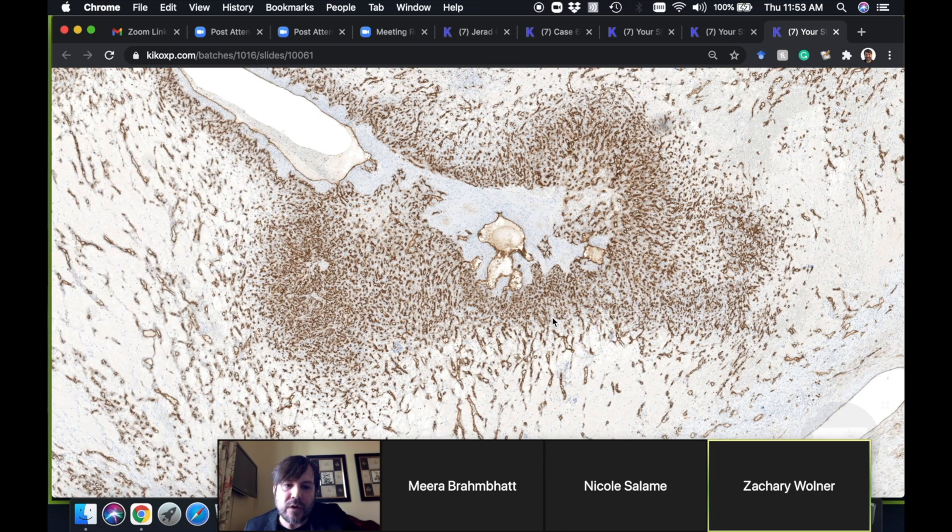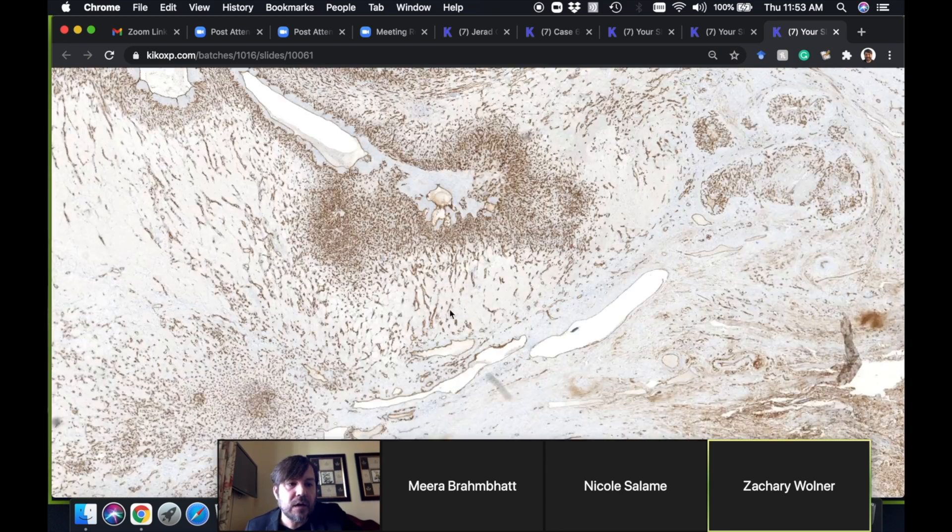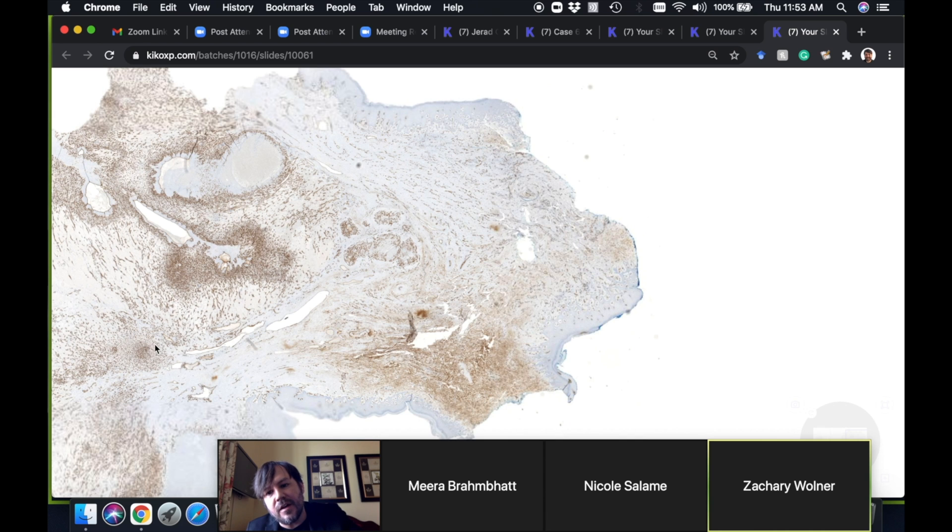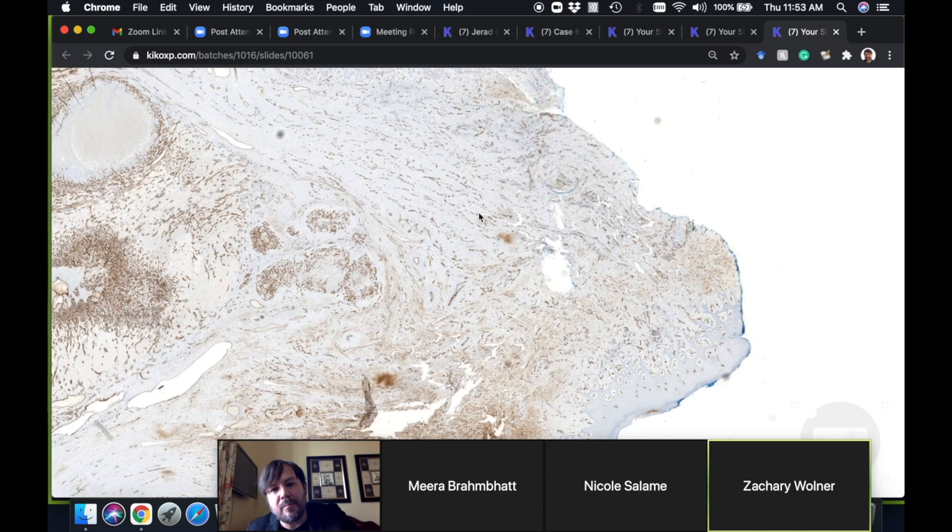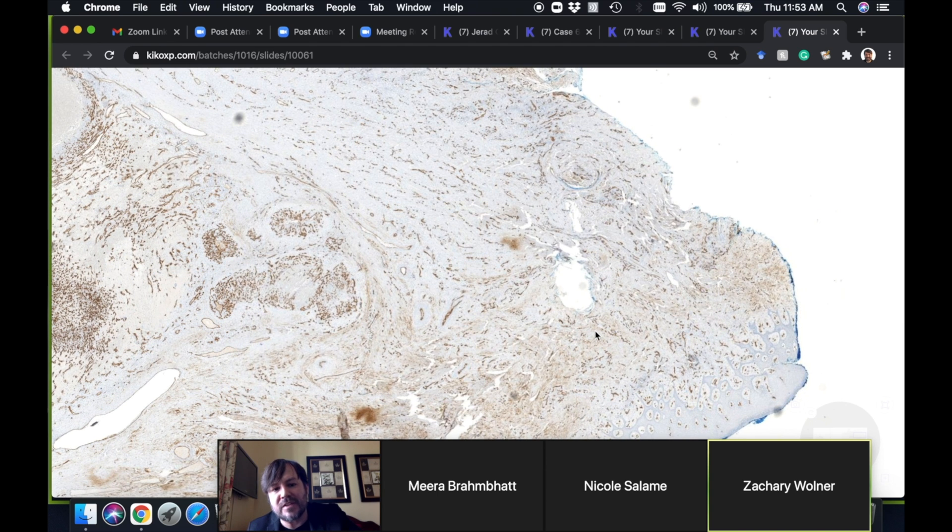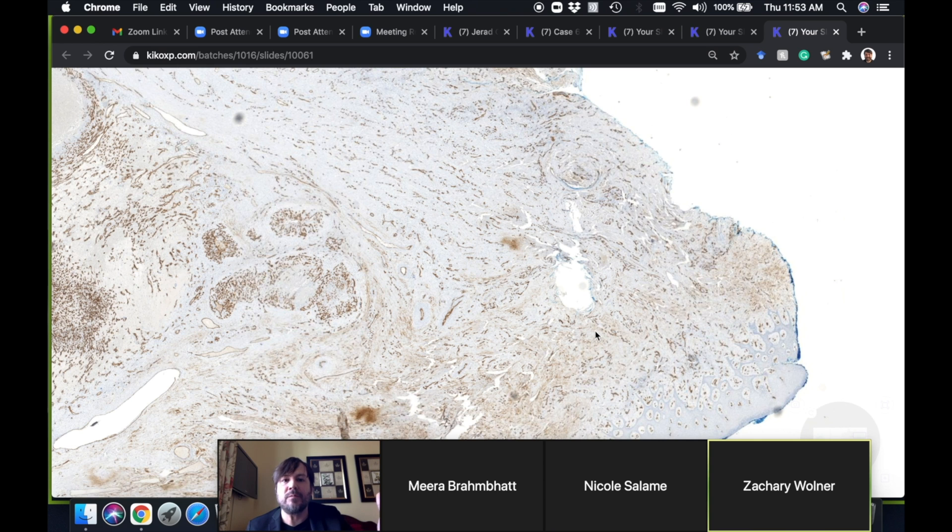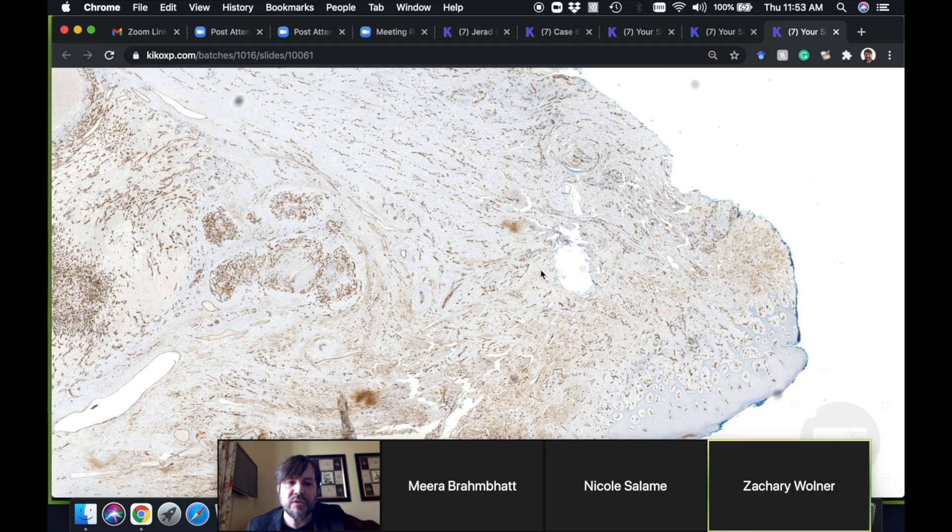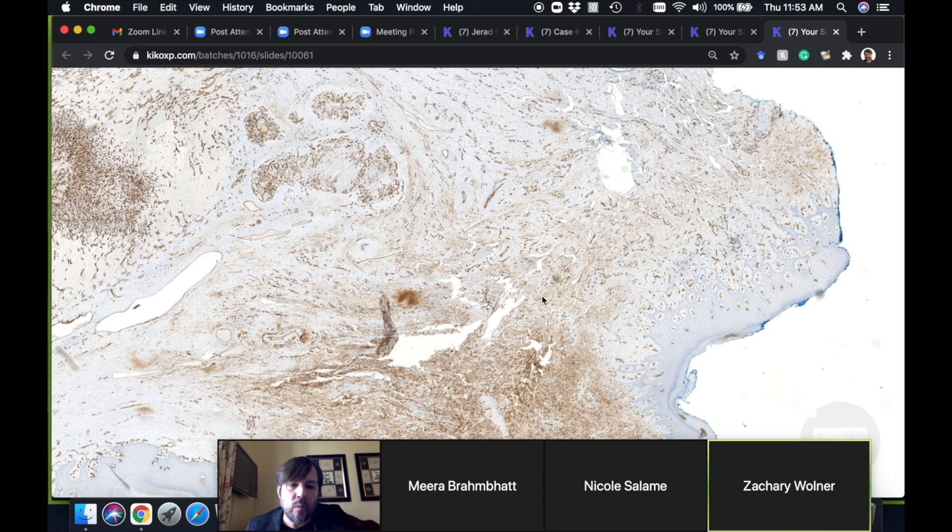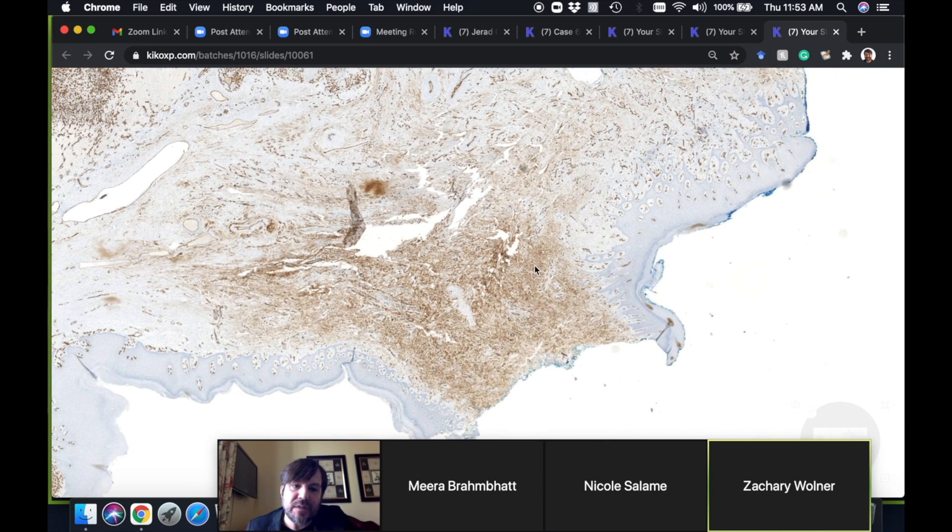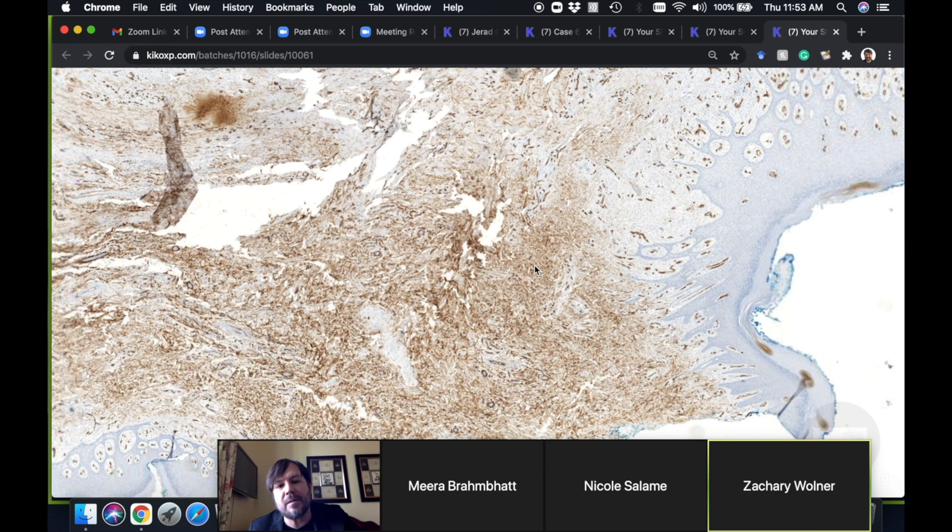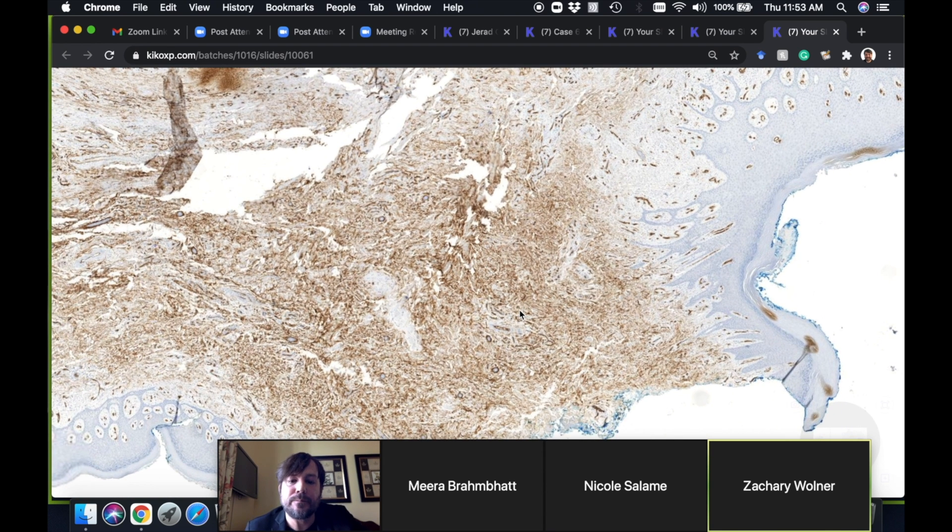Also, if we go down lower towards the stalk, you can see here that the lesion really does end there. There's a little lobule here, and then down here there's background dermal blood vessels that are kind of an increased reactive number of them because of this inflamed ulcerated surface, and surely they're recruiting some new vessel growth here. The one other thing I'd—oh, I take that back, this is not CD31, this is CD34, but it serves the same purpose. The reason I knew—how did I know this was CD34?